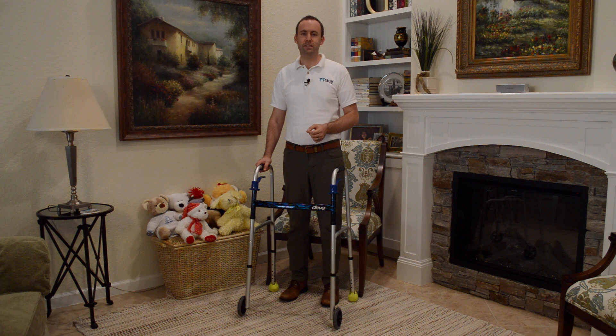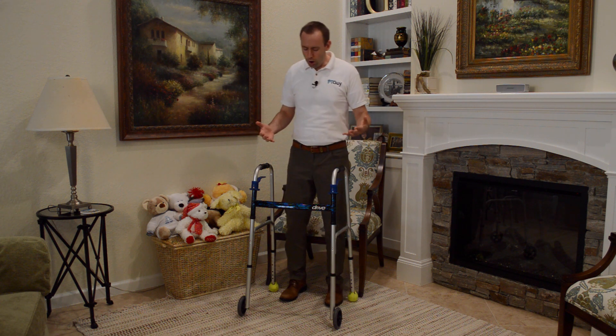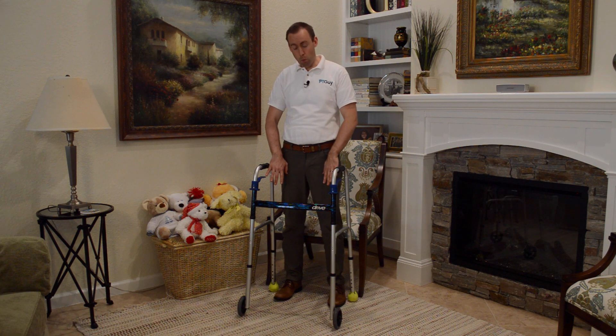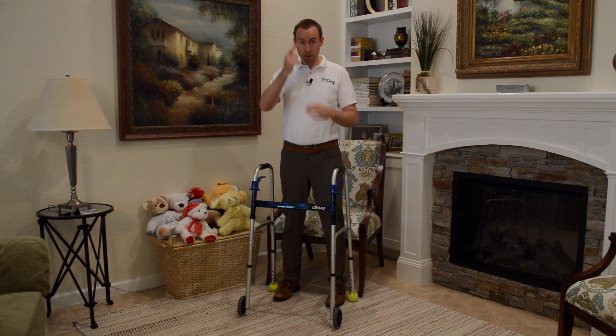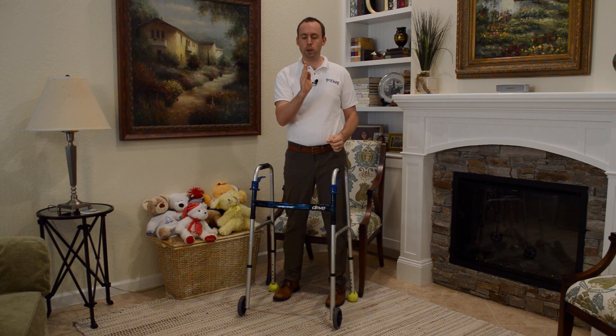Before I show you the stagger step technique, let me go over a couple of principles you need to know. If I'm standing tall to maximize my balance and I have a wide base of support with my feet spread out, I'm going to be like a pyramid — my feet are wide and I come up to a point. A big triangle sitting on the ground is way more stable than a pole sticking straight up.